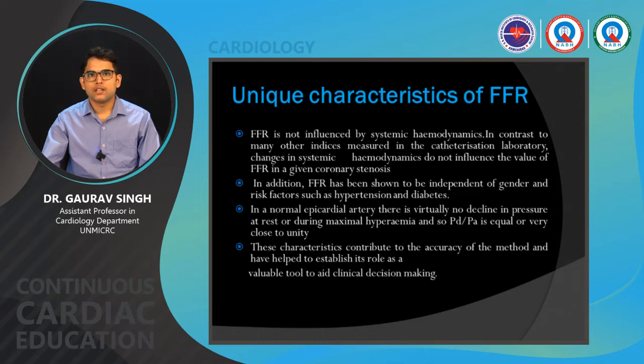In a normal epicardial coronary artery, there is virtually no decline in pressure at rest or during maximal hyperemia, and so Pd by Pa is equal to or very close to unity. These characteristics contribute to the accuracy of the method and have helped to establish its role as a valuable tool to aid in clinical decision making.